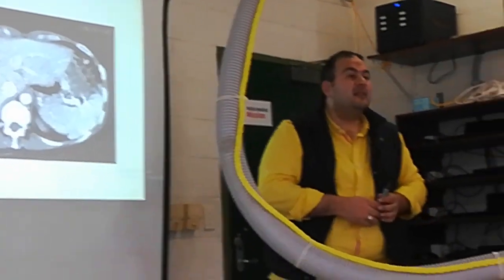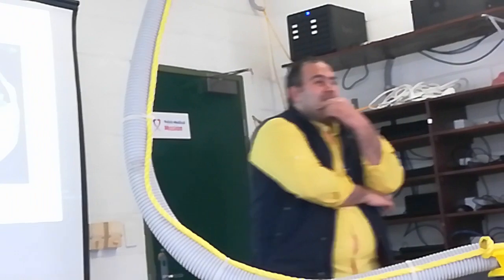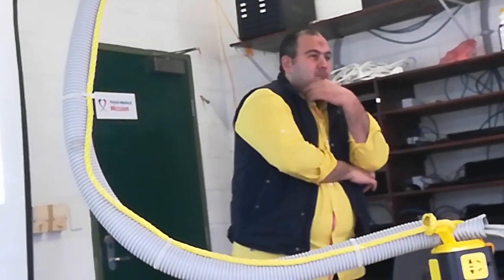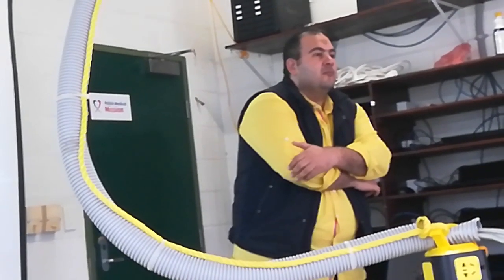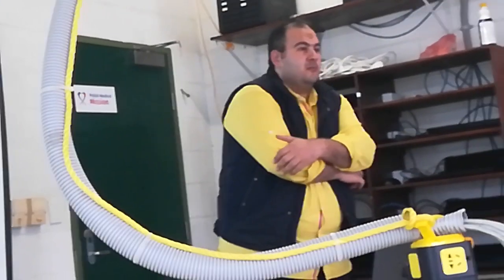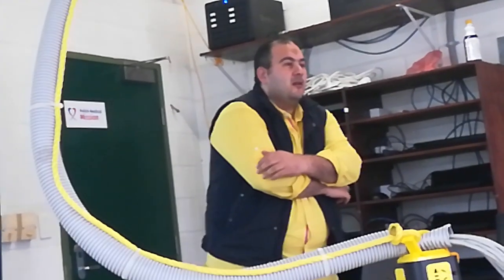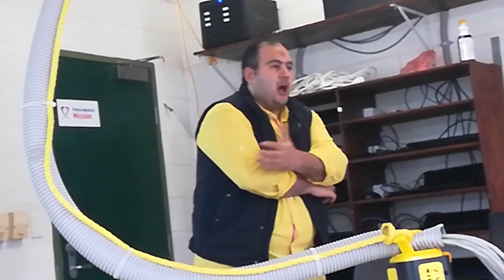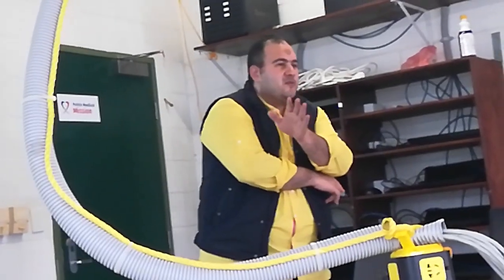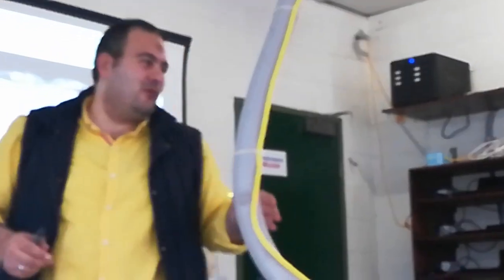Well, for now we use human learning, and that's why we use radiologists. If you get a diagnosis for an abdominal CT scan, they will tell you there's a mass in the liver with a Hounsfield unit equivalent to liver cell carcinoma. So the radiologist looks at the shape and the Hounsfield unit, and can give you a lot of parameters. Not only the Hounsfield unit, but the Hounsfield unit helps you.